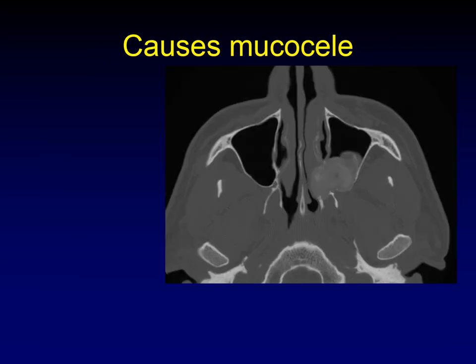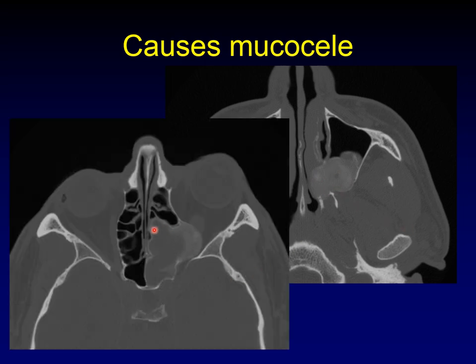Another thing fibrous dysplasia can do is obstruct outflow, similar to the foramina problem. Here is an area of fibrous dysplasia with a characteristic ground glass appearance, and here are the ethmoid air cells and sphenoid sinus that were obstructed by the expansile bone, forming a mucocele.